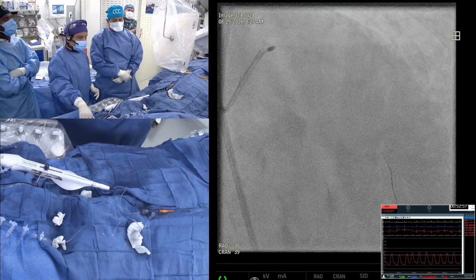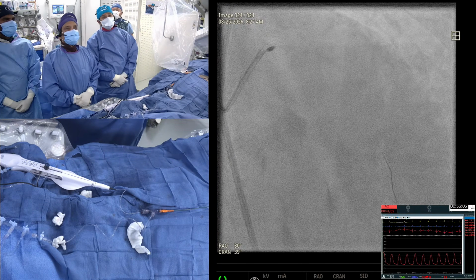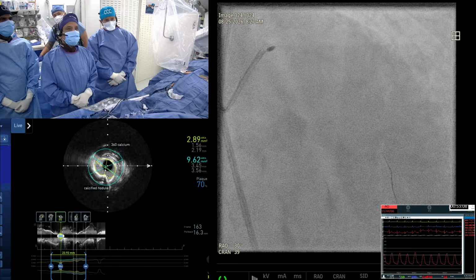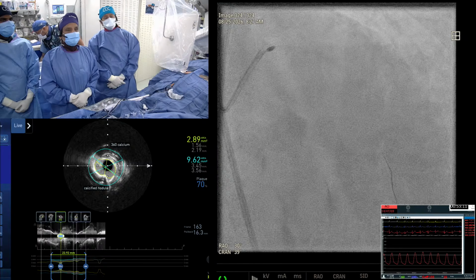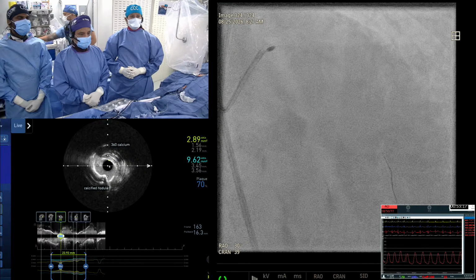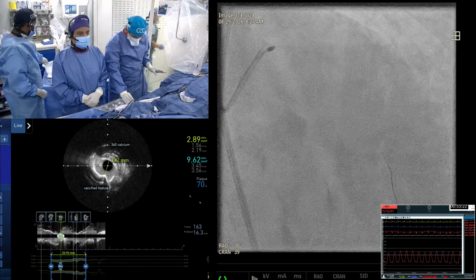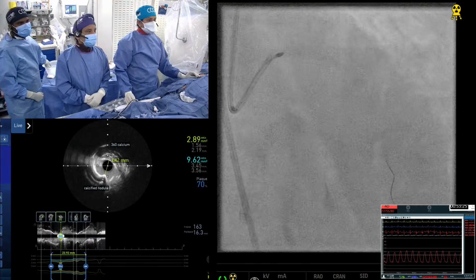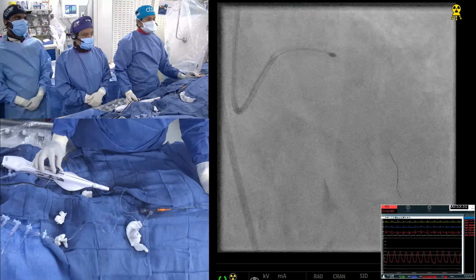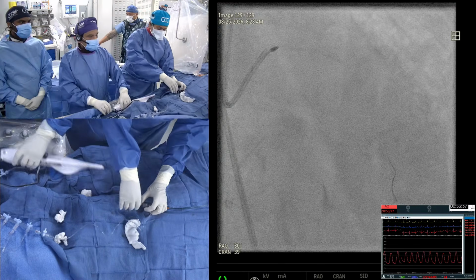So people who are using imaging and want to understand what size bar to use: show the diameter you're looking at. That's where the nodule is, and look at that, 1.5. So you cannot use a bar less than 1.5. 1.5 may barely do some kind of calcium modification, but ideally a 1.75 bar would be very good. So that's one of the teaching points for people who are learning to use IVUS and bar sizing. That's the algorithm we have created, both for nodule as well as non-nodule cases.